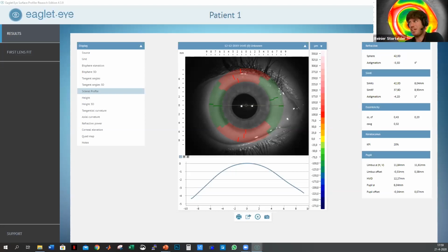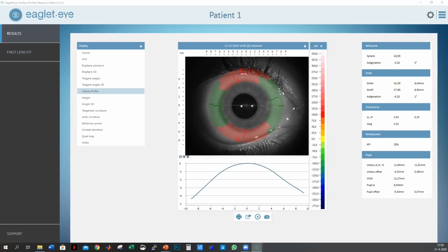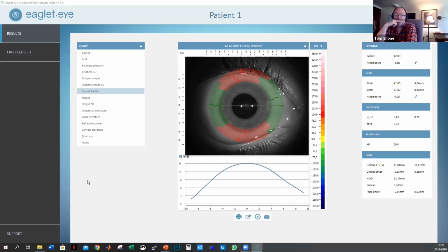Keep in mind anyway that colors are just colors. Whatever map you're pulling up, the colors mean something different. So always check the sidebar for what the colors actually mean for that particular map. That's very true. Okay. Any more questions before we wrap it up?